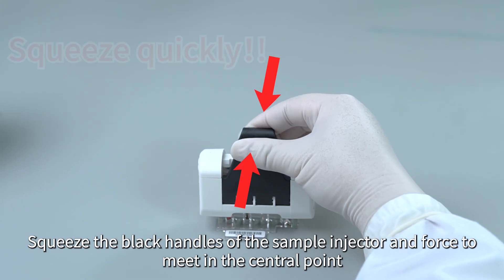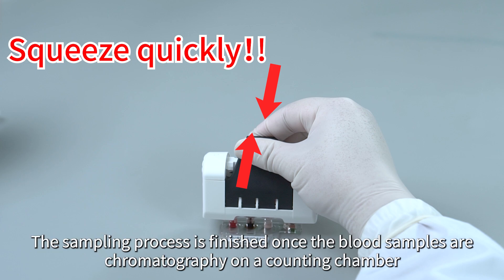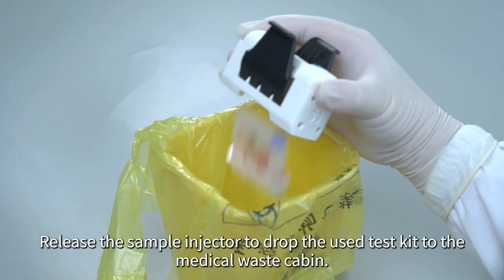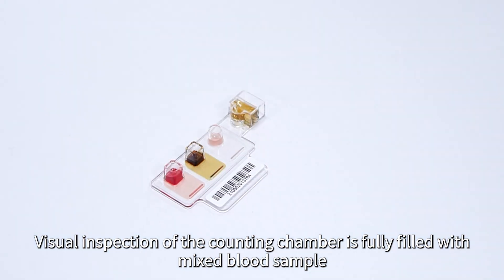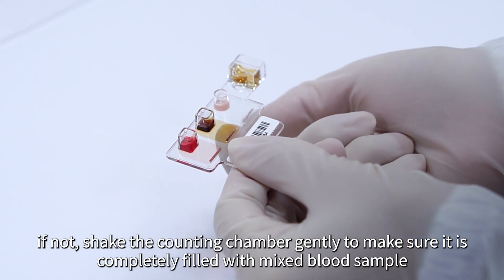The blue part will be lifted up once the test kit is embedded in the sample injector completely. Squeeze the black handles of the sample injector and force them to meet at the central point. The two black handles will be locked after they meet at the central point. The sampling process is finished once the blood samples are chromatographed on the counting chamber. Release the sample injector to drop the used test kit into the medical waste cabin. Visually inspect that the counting chamber is fully filled with mixed blood sample. If not, shake the counting chamber gently to make sure it is completely filled.